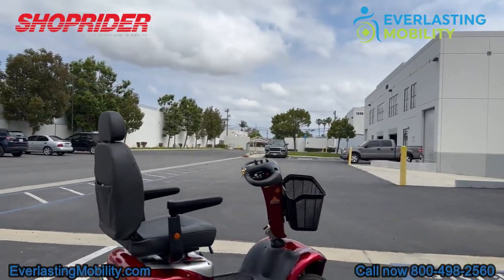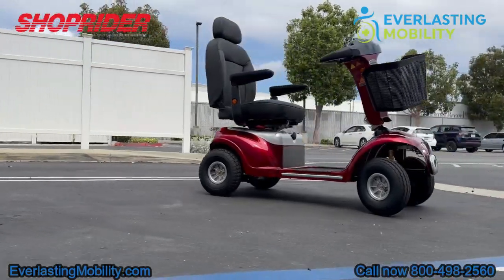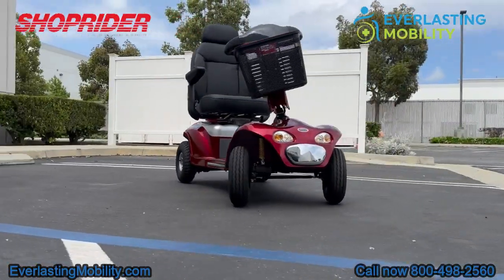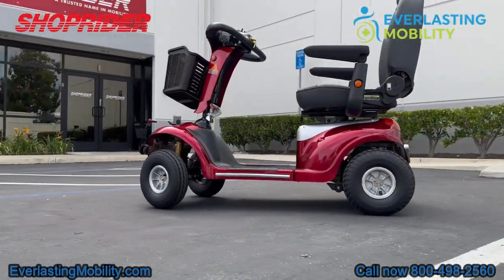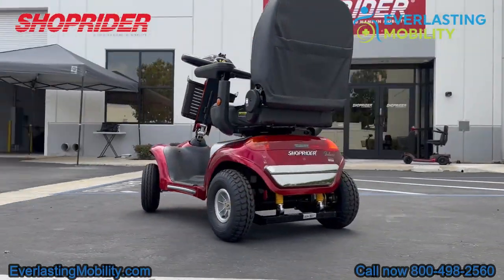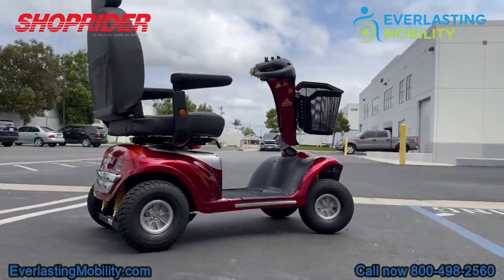In conclusion, if you are looking for a well-made heavy-duty mobility scooter that is reliable, comes with four 12-inch pneumatic tires, a full lighting package, and smooth front and rear suspension, along with an ultra-comfortable high-back captain seat that can swivel and slide forwards and backwards, the Enduro XL4 is worth considering.